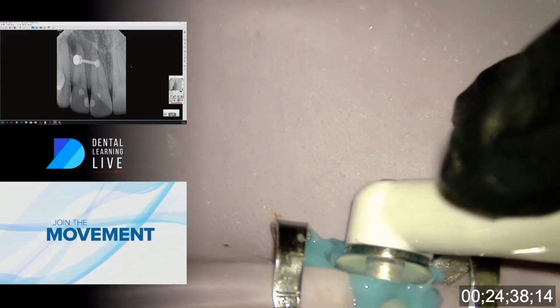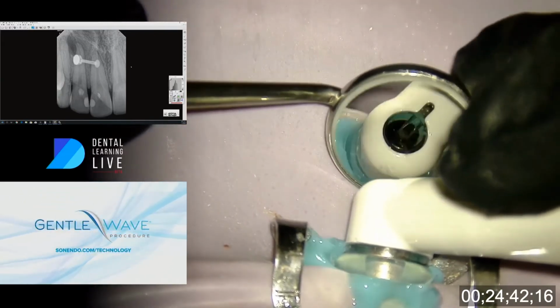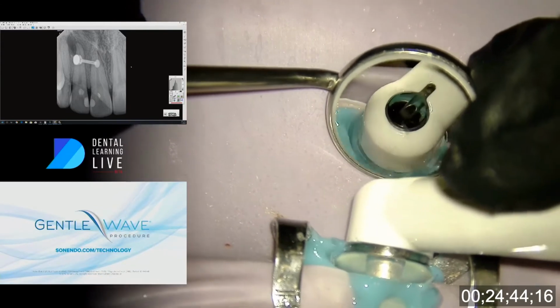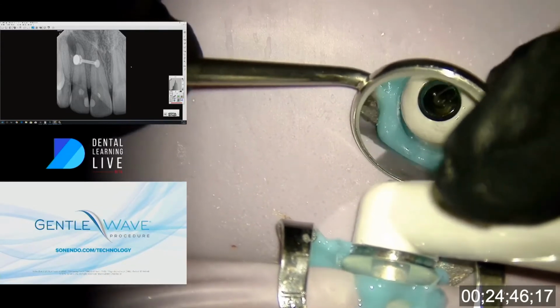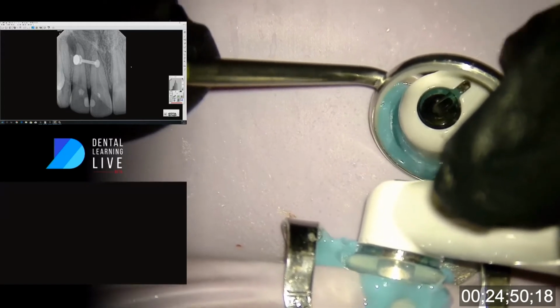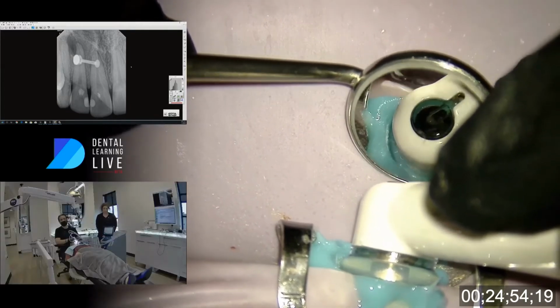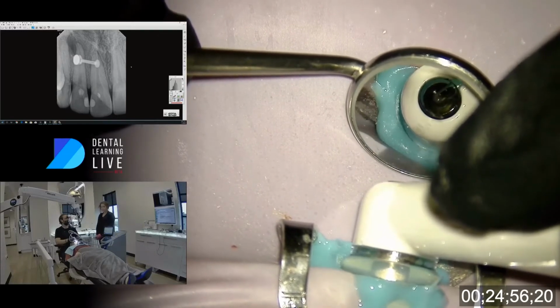And so, the look of what I thought was a sexy root canal is now a little bit different. We want to see some fireworks and believe that we get advanced healing in that way. So let's see, we got a minute left of the sodium hypochlorite.